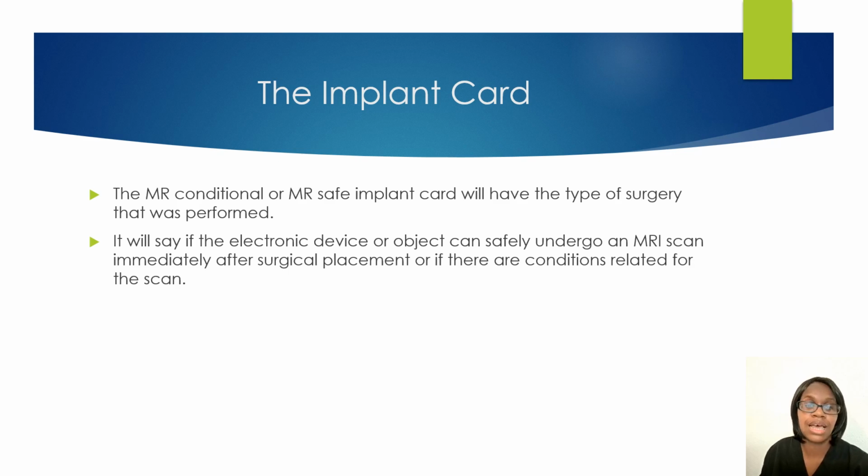So there was a time where a patient thought they had a loop recorder implanted, but it was actually a pacemaker. So sometimes patients do not know what they have. They may get confused or they didn't understand what the doctor told them they had. So that's why it's good to verify that information with the patient and their implant card.